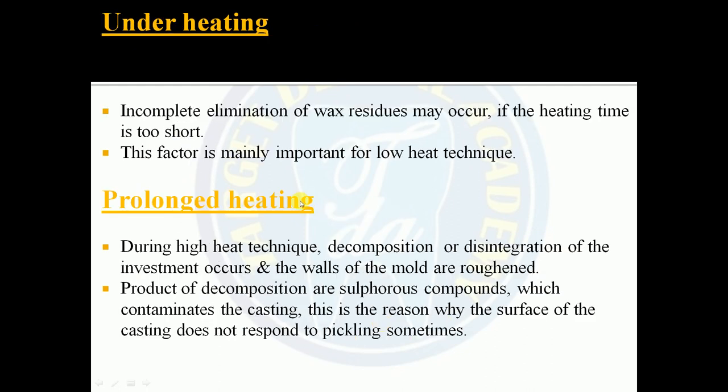Coming on to the underheating. Incomplete elimination of wax residue may occur if the heating time is too short. This factor is mainly important for the low heat technique. While prolonged heating in the high heat technique leads to decomposition and disintegration of the investment and makes the mold rougher. The products of decomposition are sulfurous compounds which contaminate the casting.